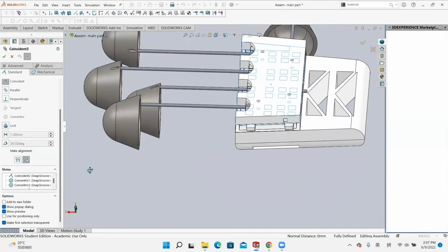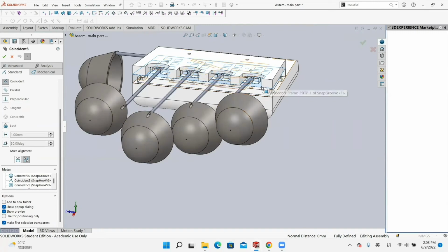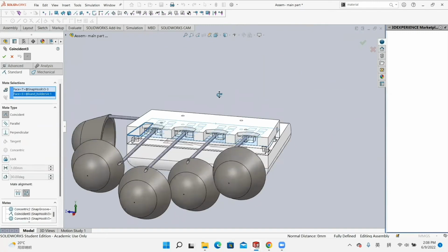We have the band holder on the top of the snap hooks parts since we will place the elastic cords inside between the gaps of each hooks. By doing that, we use the coincident mate, choosing the top face of the snap hooks part and the bottom face of the band holder.